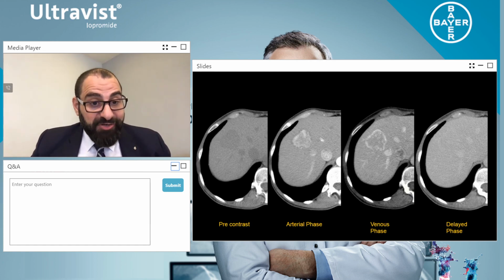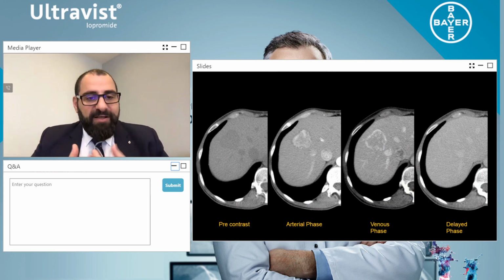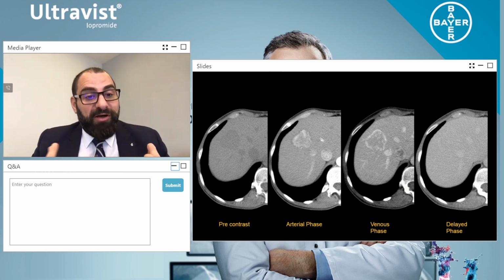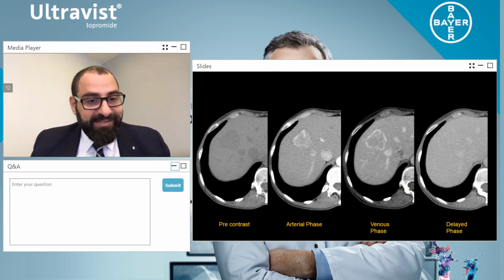If I look at my pre-contrast, it's a hypo to iso intense lesion density. When I look at the arterial phase, I see a well circumscribed, heterogeneously enhanced lesion. At the venous phase, more importantly, the actual lesion has washed out, but the wall of the lesion is enhanced, and it's equally enhanced relative to the liver parenchyma. And then at my 10 minute delay, you can see the lesion has completely disappeared.